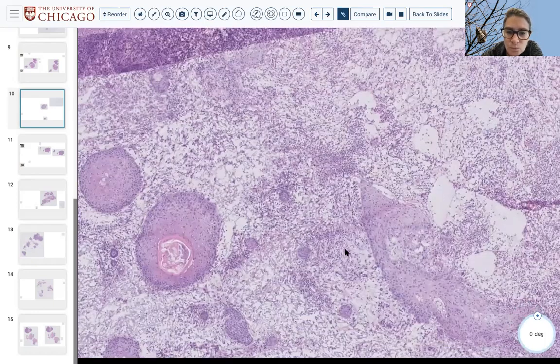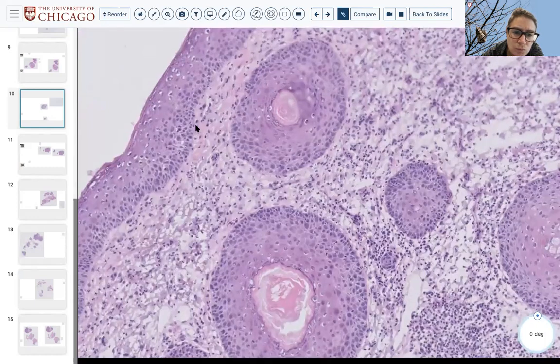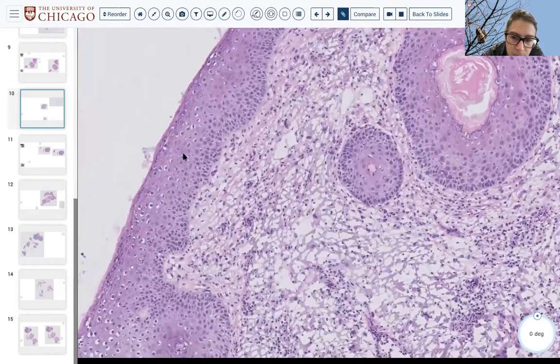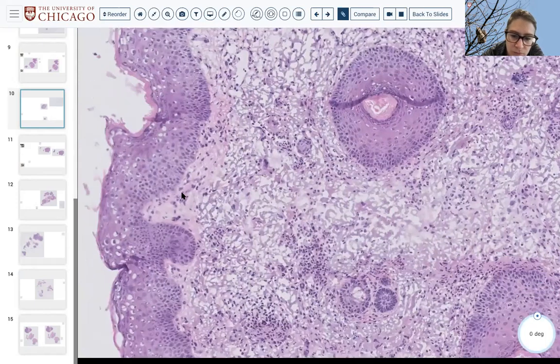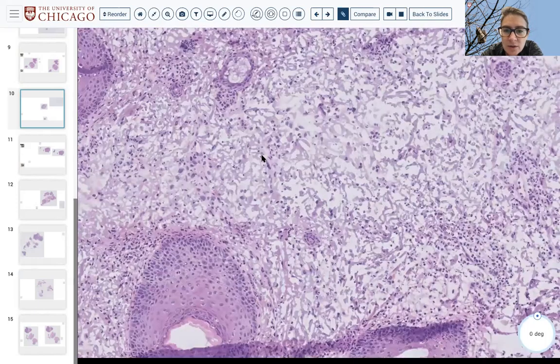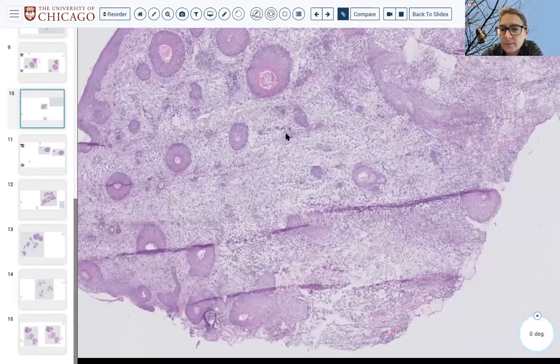The skin is also exhibiting some dysplasia, but I don't think this is arising from the skin itself. I don't know if this is maybe a metastasis from a different area. It's kind of hard to say. Do you want to drive and tell me where you see the carcinoma? Want to take control of my screen? I'll try.